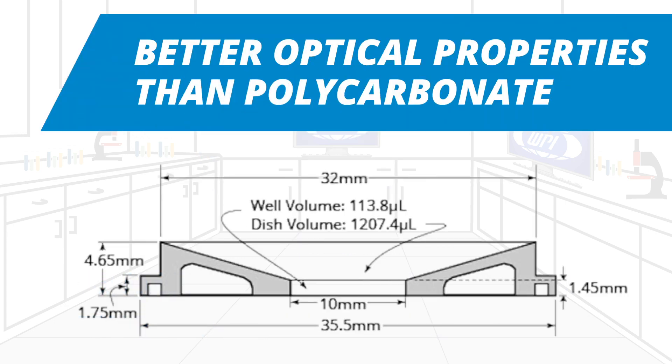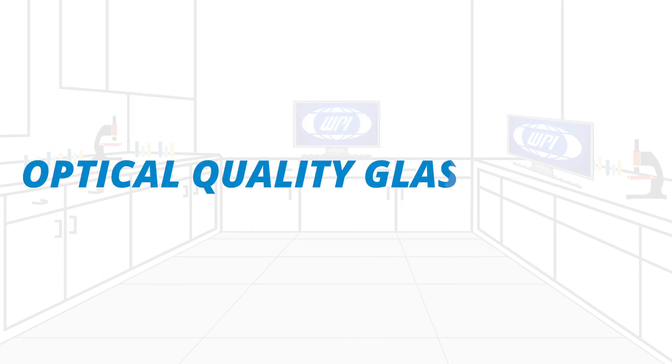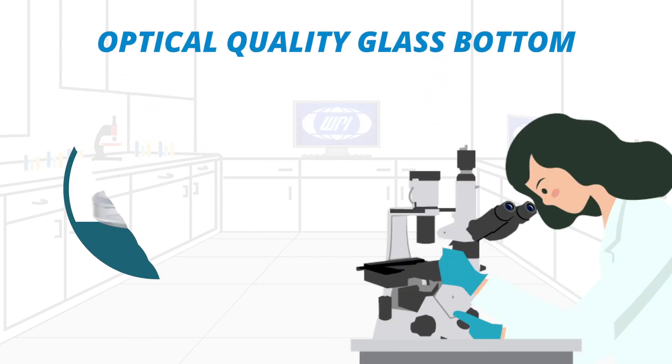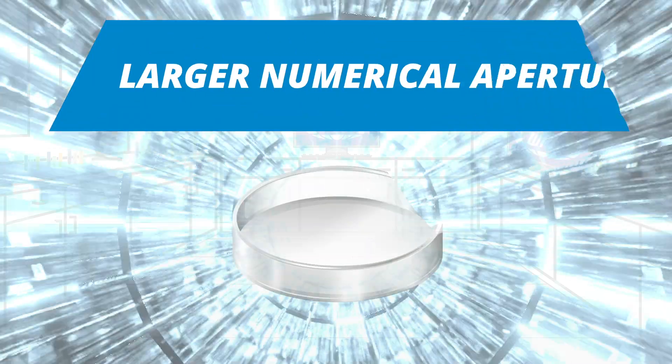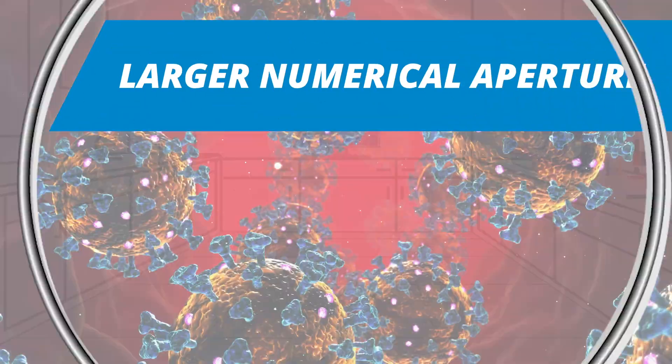Each WPI dish has a flat, optical-quality glass bottom, allowing the use of a much shorter working distance, larger numerical aperture, and higher magnification.